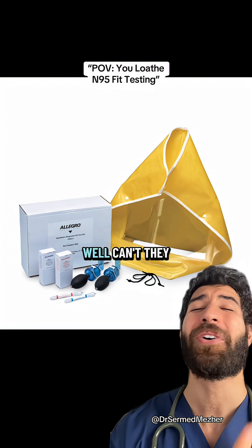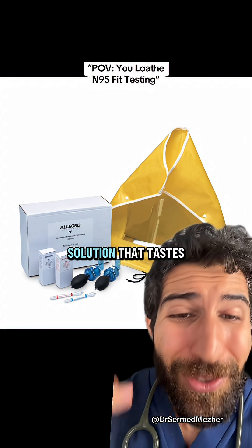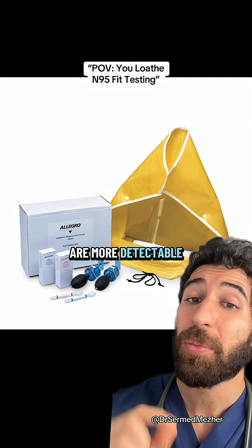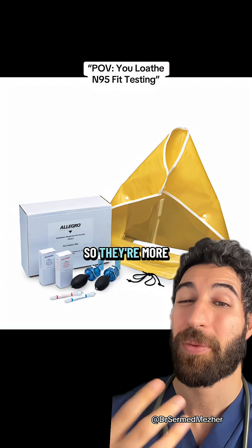Now the even sharper of you will say, well can't they just use a solution that tastes like rainbows instead? But bitter solutions are more detectable at lower concentrations, so they're more sensitive.